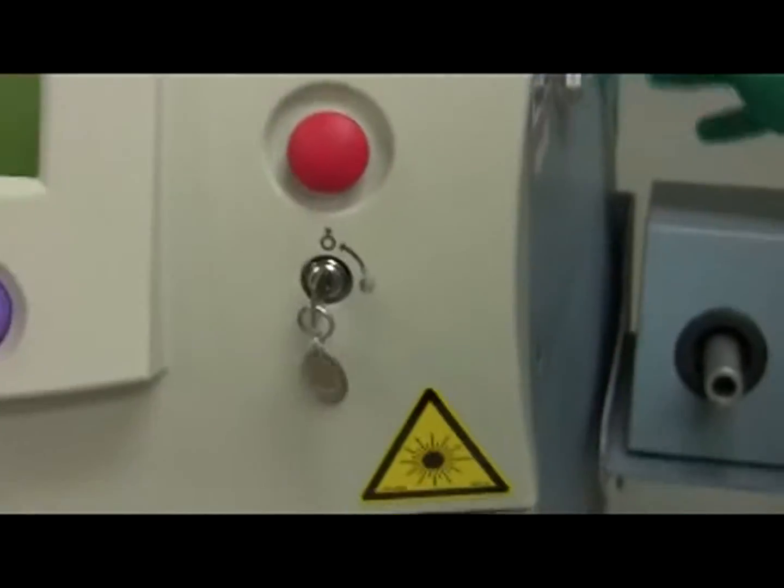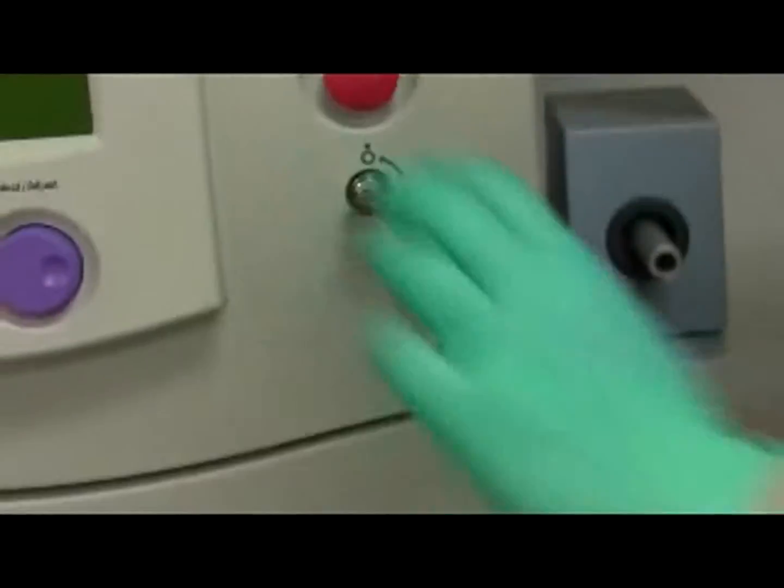Turn on the laser by turning the key at the front of the machine clockwise to the circle with the dot inside. If the power does not turn on, make sure the machine is plugged in.